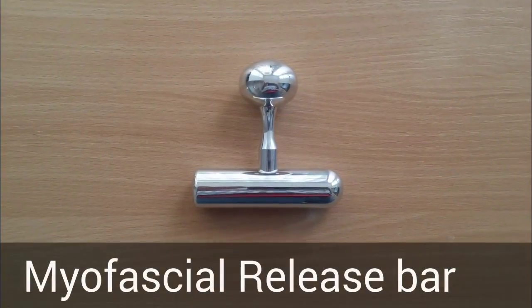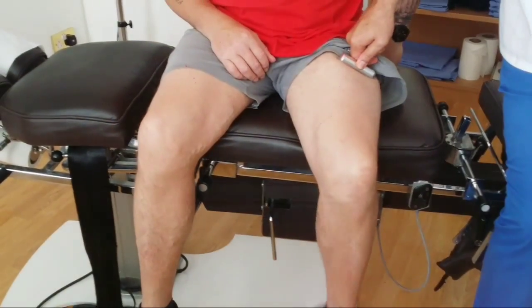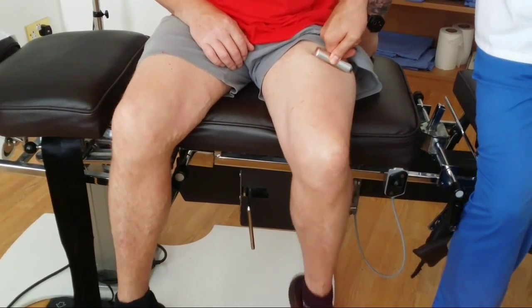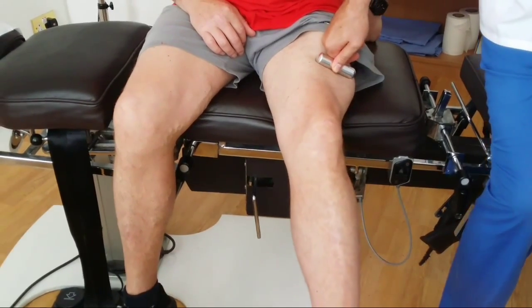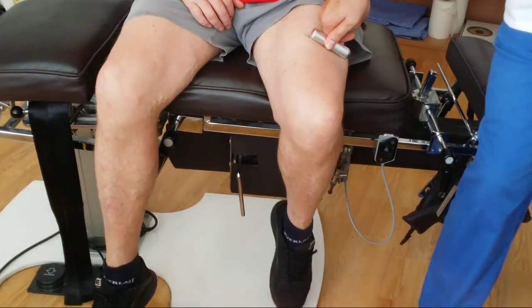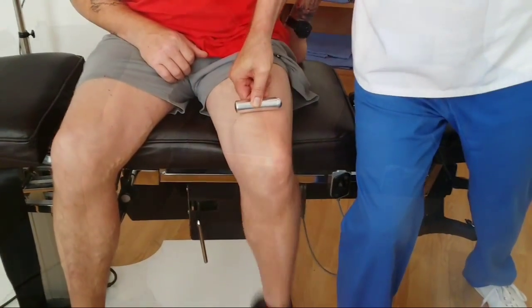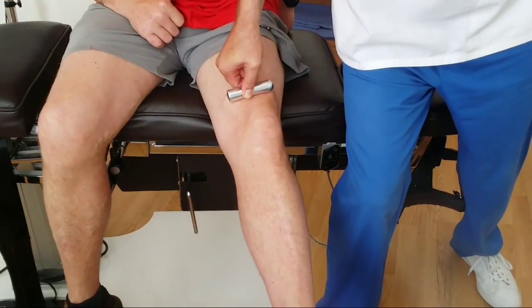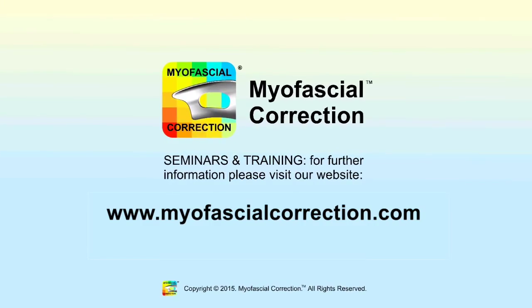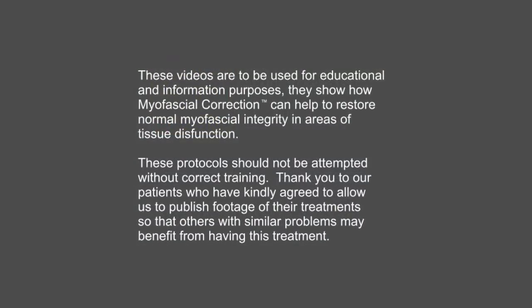Our myofascia release bar has been designed to transmit force from the operator to the fascia and underlying muscle. The protocols developed for this myofascial release are very effective, powerful and simple to use. Our instrument design enhances our myofascial correction protocols, providing a very quick and effective treatment of the myofascial component of injuries.